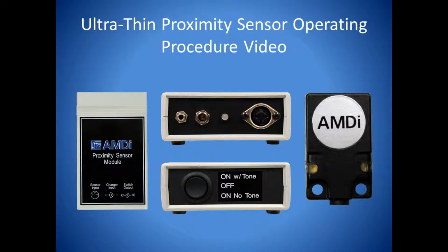Welcome to the ultra-thin proximity operating instructional video. The ultra-thin proximity sensor is good for end users that need to use a switch that can be activated with little or no touch. If the end user fatigues easily from a mechanical switch, then the proximity sensor switches are a good solution.